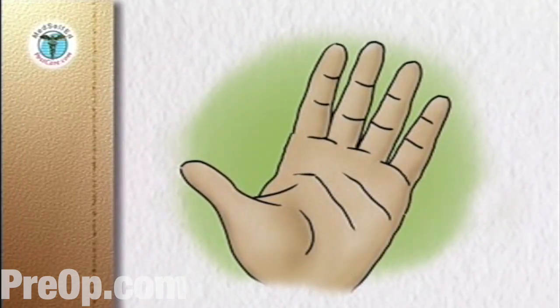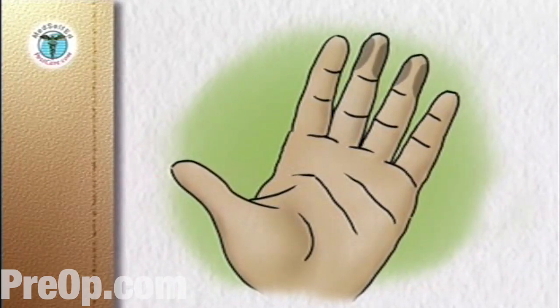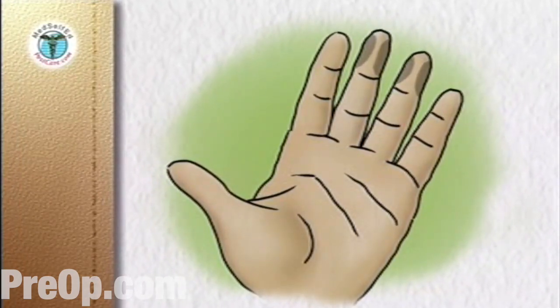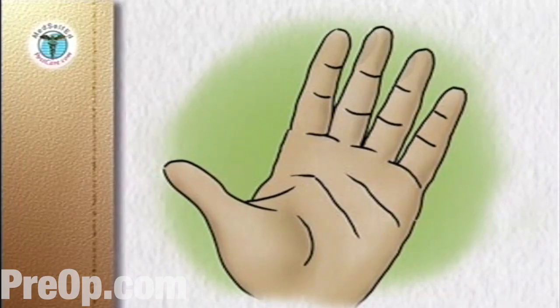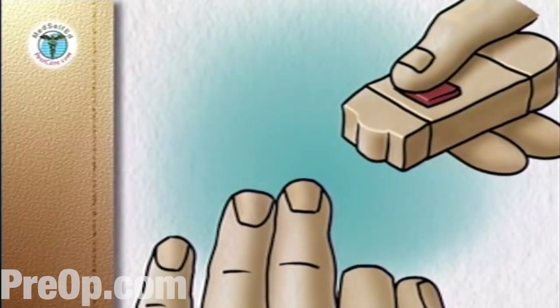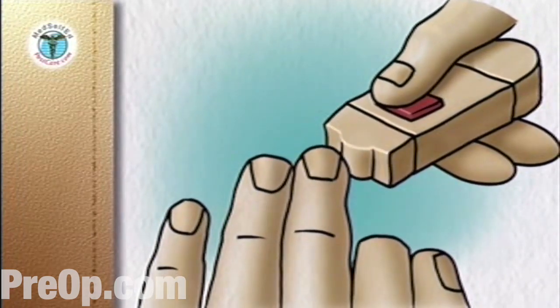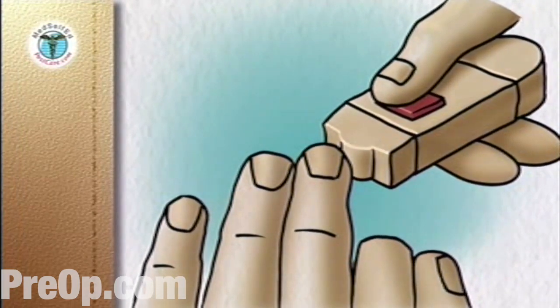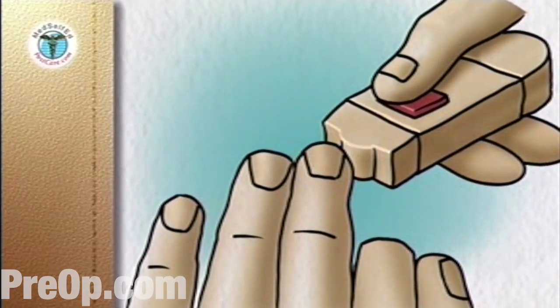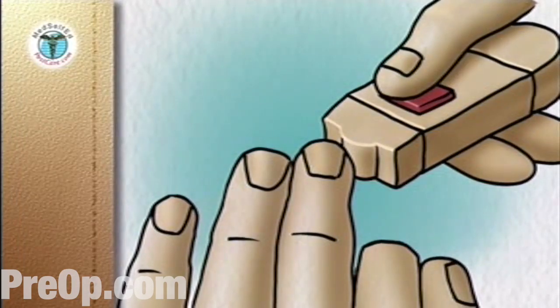Choose your puncture site — the sides of the end segment of the finger are the best sites. Stroke down the finger to push blood toward the puncture site. Place the end cap firmly against the chosen puncture site on the side of the fingertip. The more pressure you use, the deeper the puncture. Push the lancet release button without moving your finger or the device.